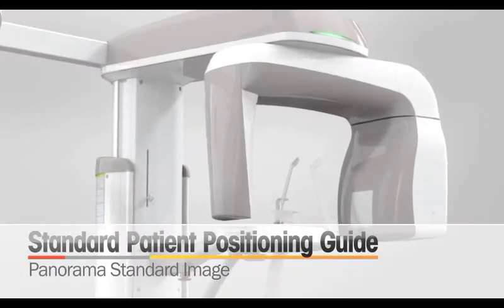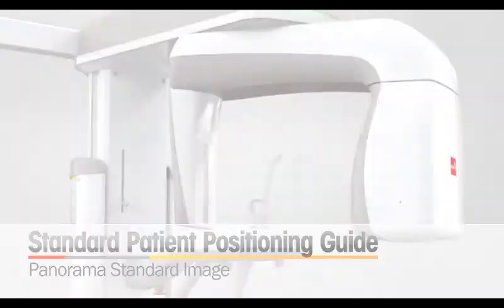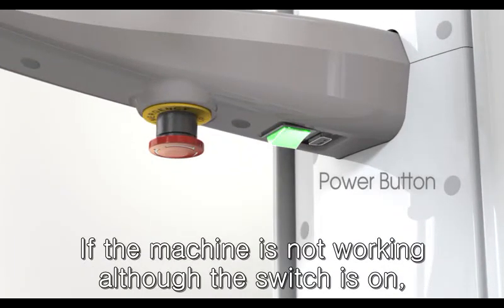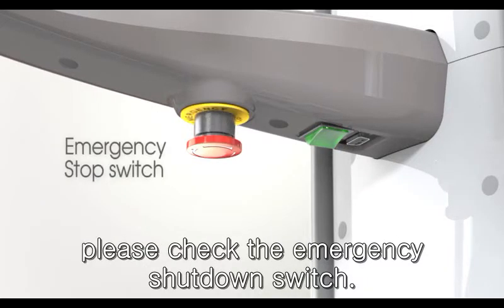Now, we start the standard patient positioning guide for Panorama Standard Image. First, please turn on the switch. If the machine is not working, although the switch is on, please check the emergency shutdown switch.